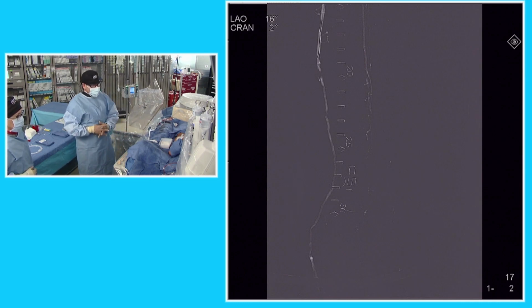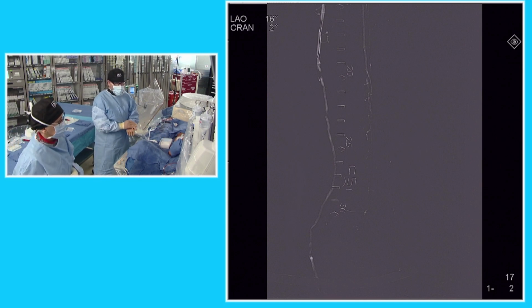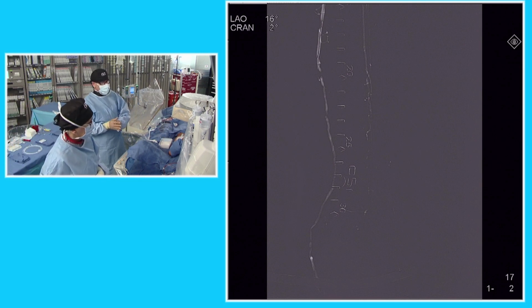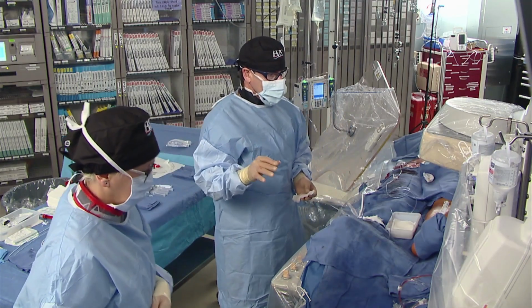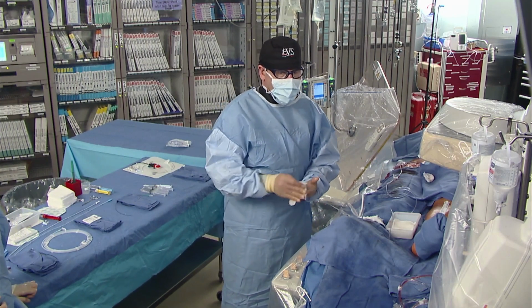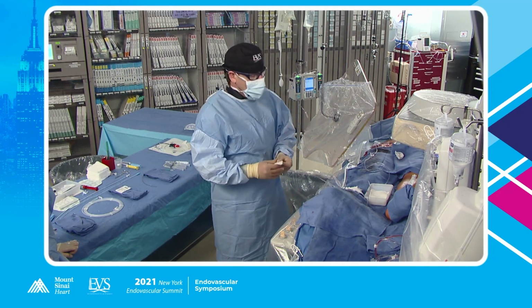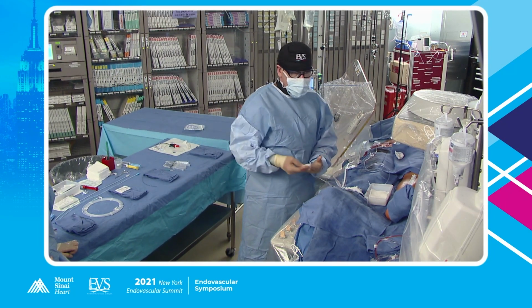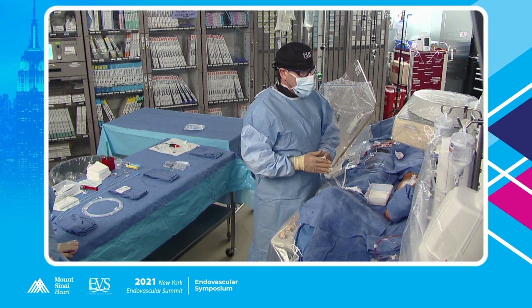So our plan then today, we actually were going to, until it got worse, Sahil Parikh was on the first panel. This was going to be a LIFE BTK because it allows you to fix the inflow, and as long as you do that successfully, gives you the option of a drug-eluting bioabsorbable scaffold in a tibial vessel like this. But we chose to go ahead and proceed today because of many, many factors. So it will not be in the LIFE BTK trial.